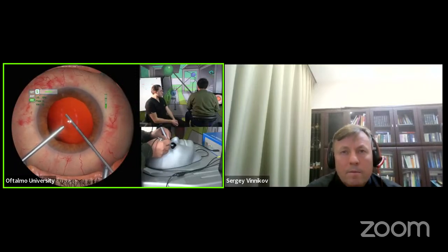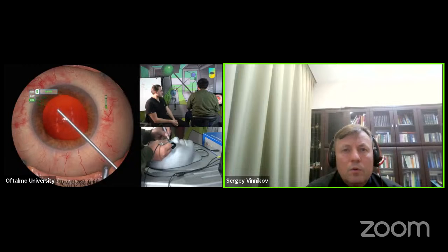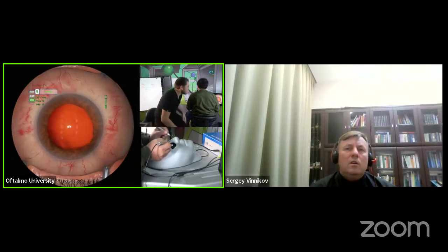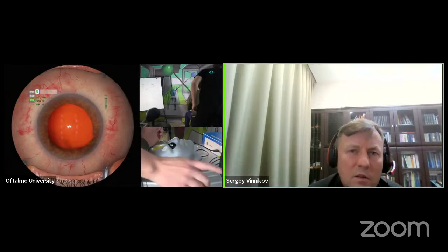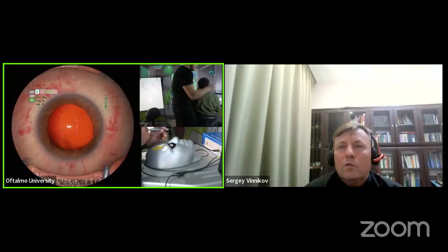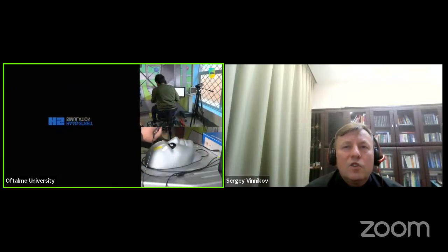Okay. Так, сейчас вводим вискоэластик, и только после этого убирается ирригационная канюля. Вот, я думаю, сейчас посмотрим на счет. Я думаю, гораздо выше, чем 0. Посмотрим.